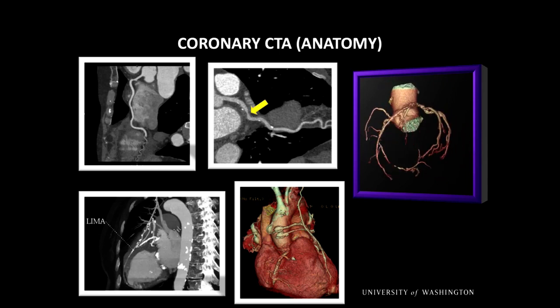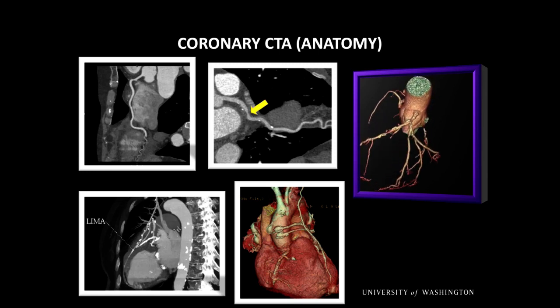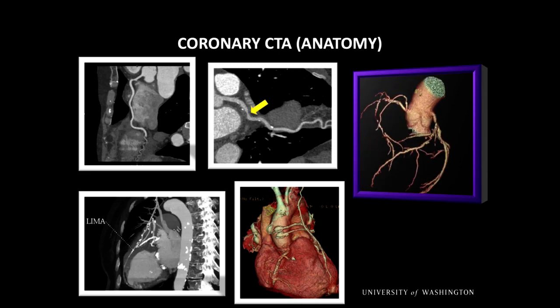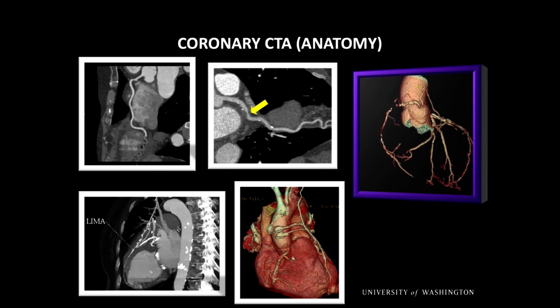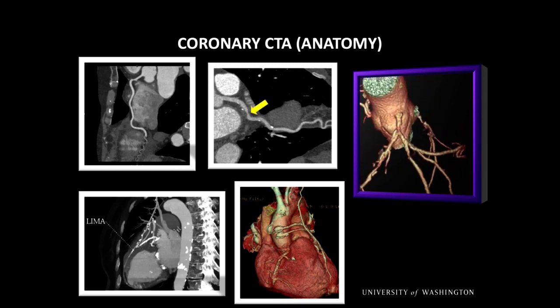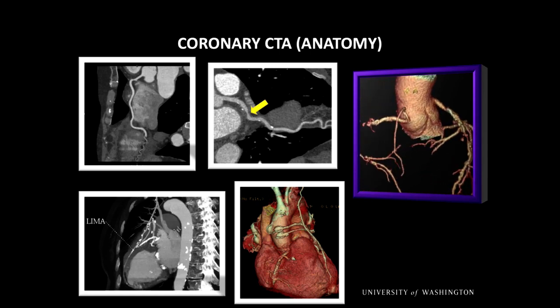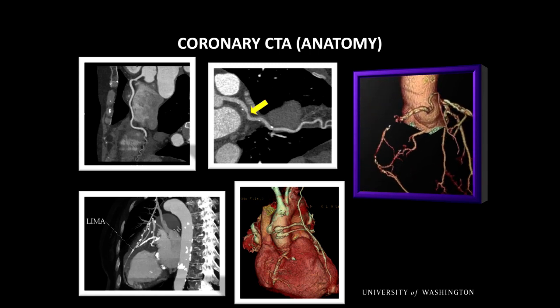And I think someone who always struggled in the cath lab to engage bypass grafts, it's nice to be able to just sit here at a computer, use a monitor, and just kind of look at them that way. So this is really nice. And then you have your 3D image that just rotates around like that, which I don't know how much it adds, but it certainly makes for these nice presentations here.